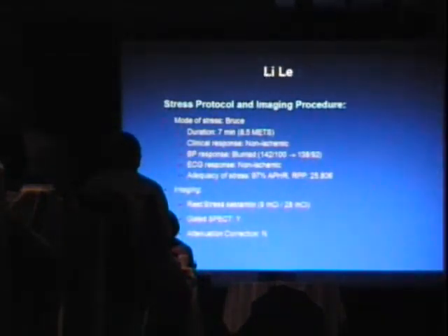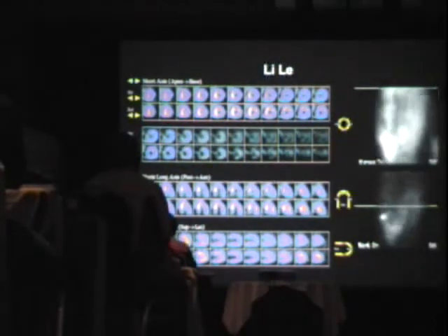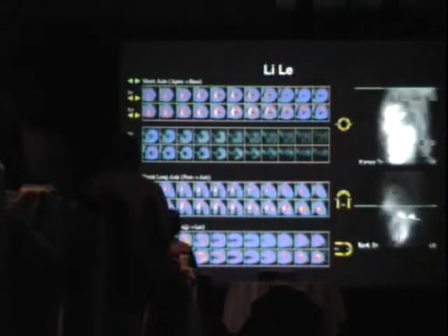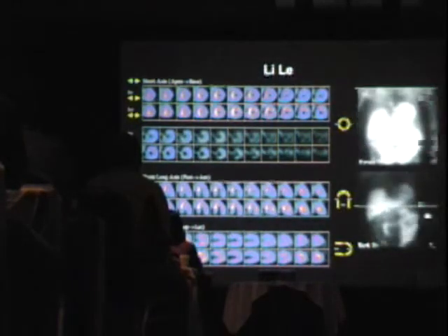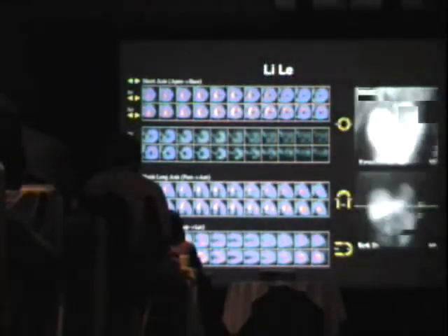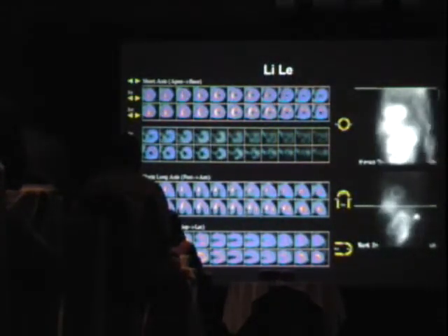Another potential source of artifact is a patient with a heart transplant who comes for the annual evaluation looking for coronary disease. Good exercise, no chest pain, no ECG changes. And you get a scan that looks like this. What you would notice here is that the arms of the patient are down, not up. The typical imaging for cardiac, again, needs at least the left arm out of the field of view.